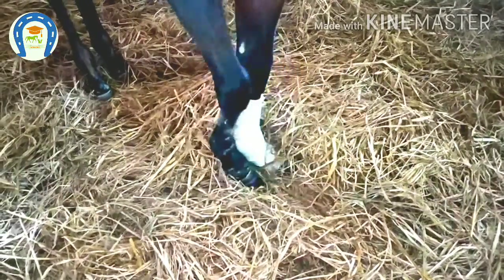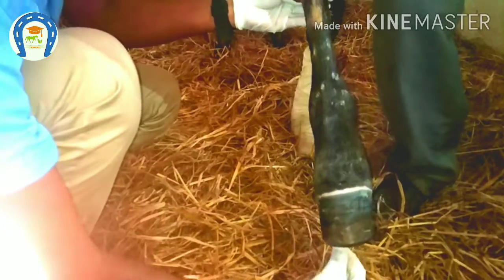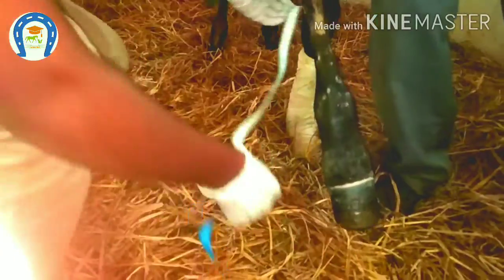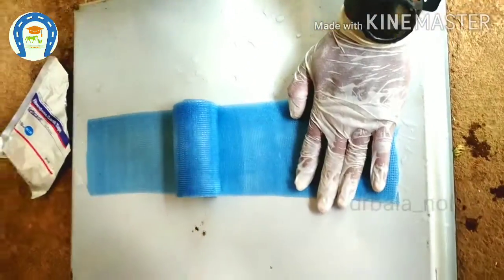Now we will apply a splint to immobilize a joint in a foal. I want to immobilize the pastern joint in this foal. I am measuring the length to prepare the splint. We have measured the length and now I am cutting.